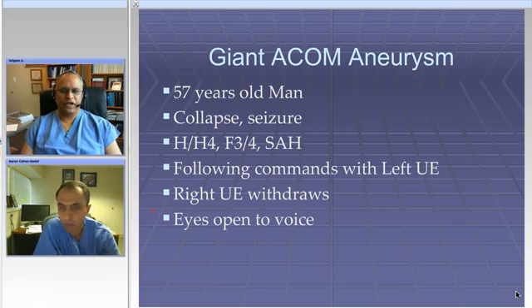Absolutely. That's a very good point. The question is, why didn't I use a fenestrated clip, and why did I bring a clip around the other aneurysm? Well, the fenestrated clip definitely has advantages, which is that in the fenestration you can preserve the ipsilateral vessel. There are some disadvantages, however.